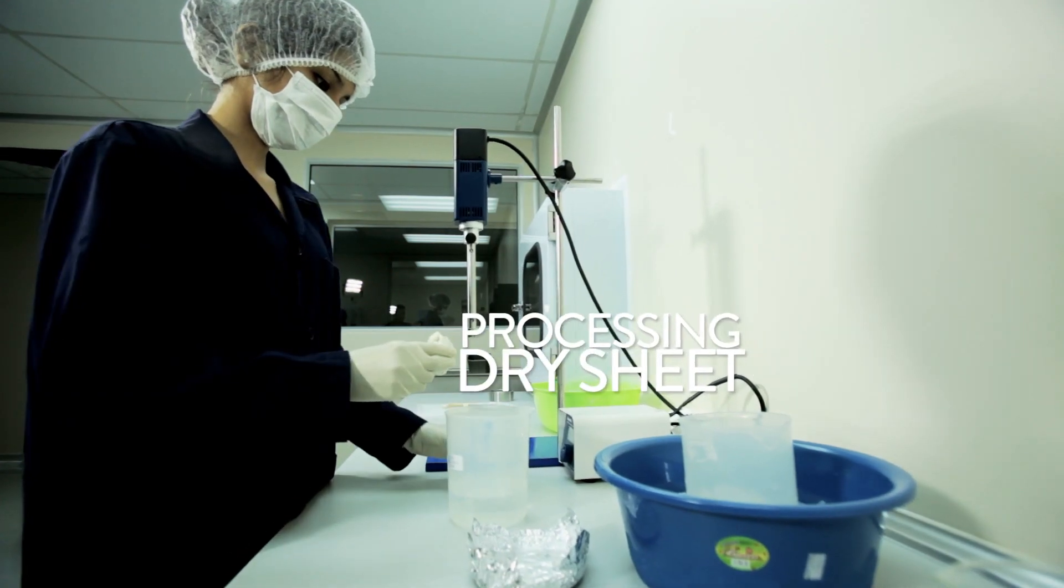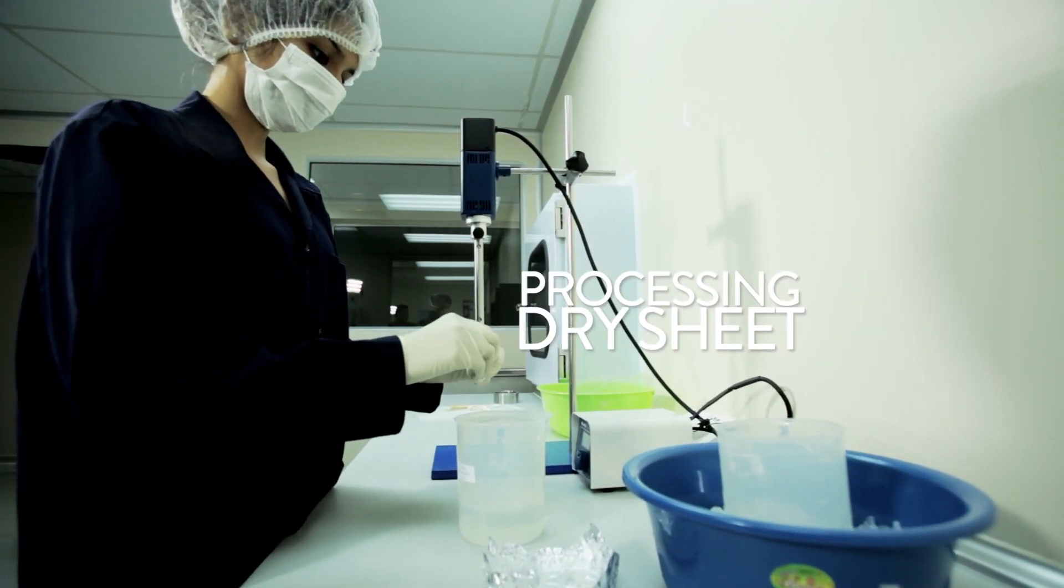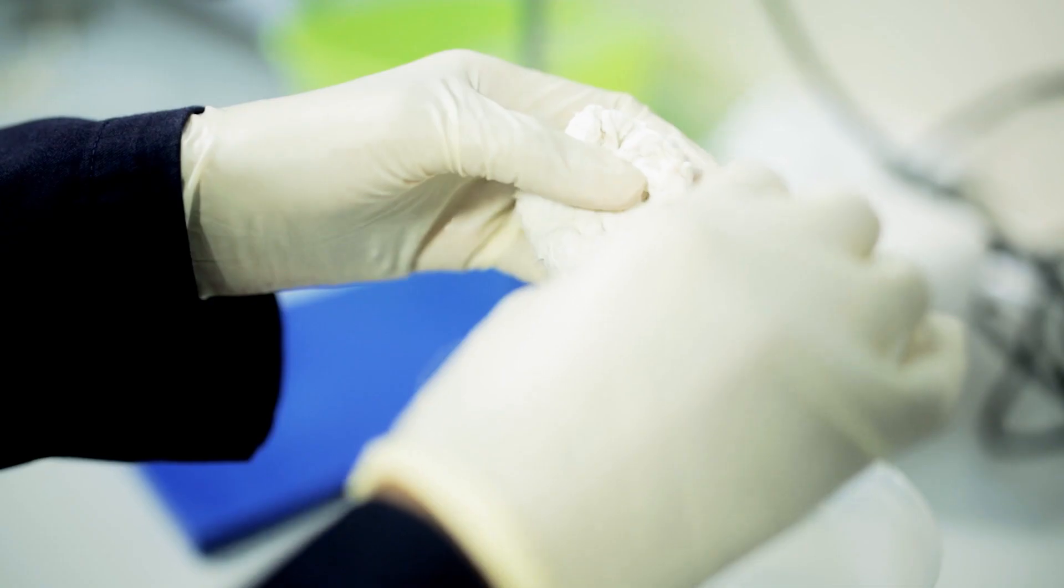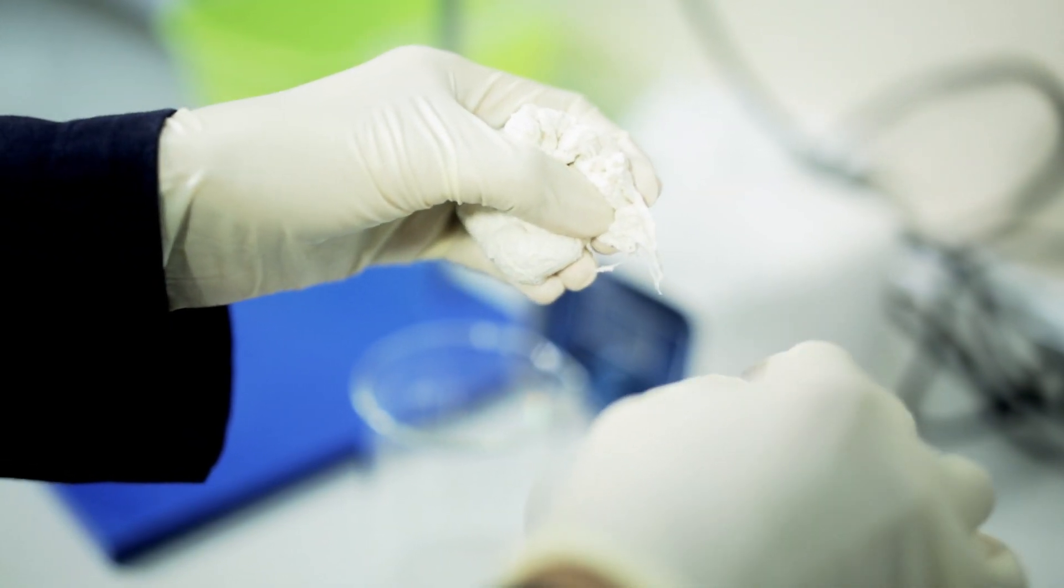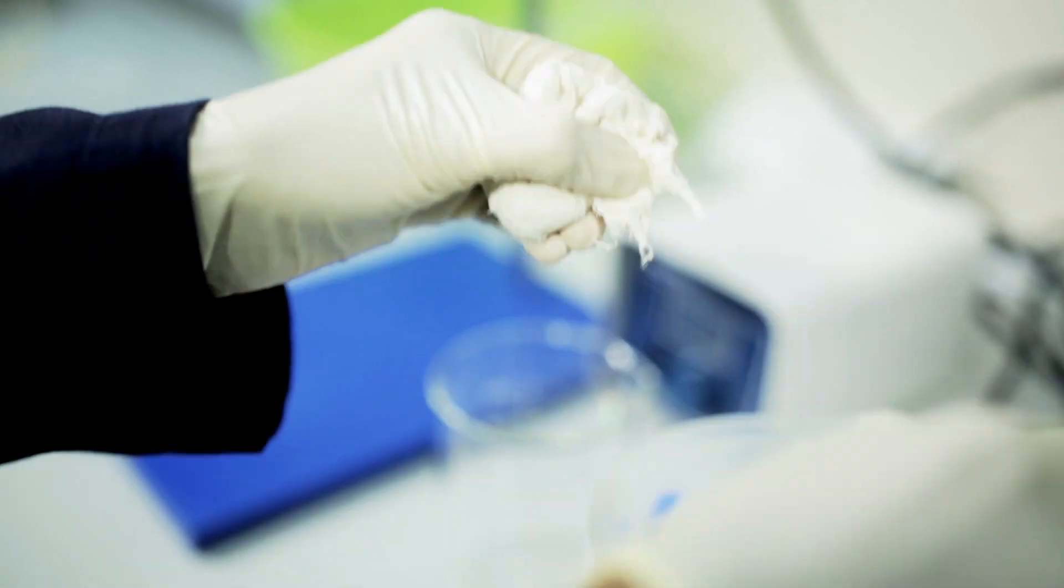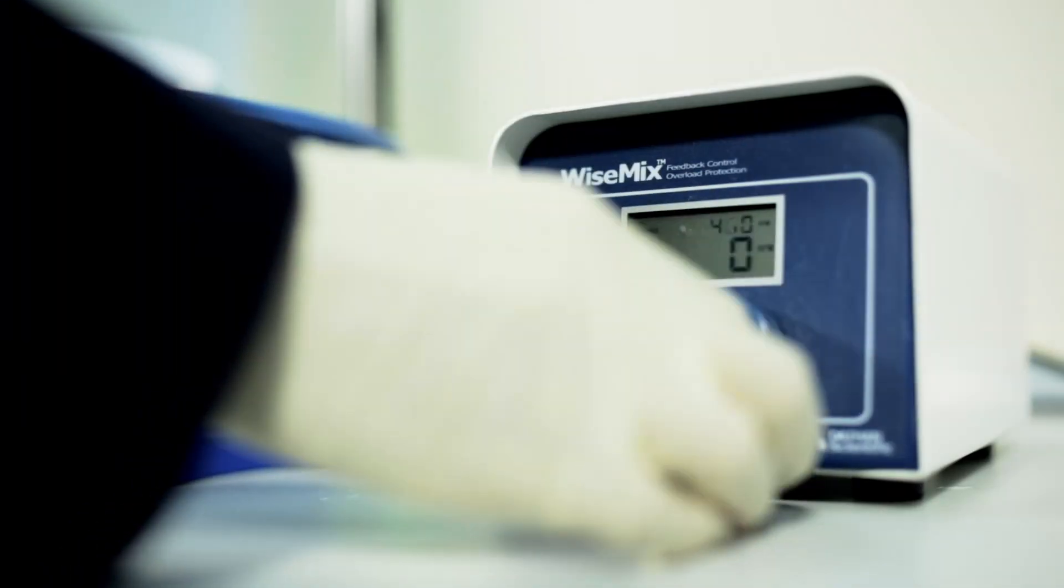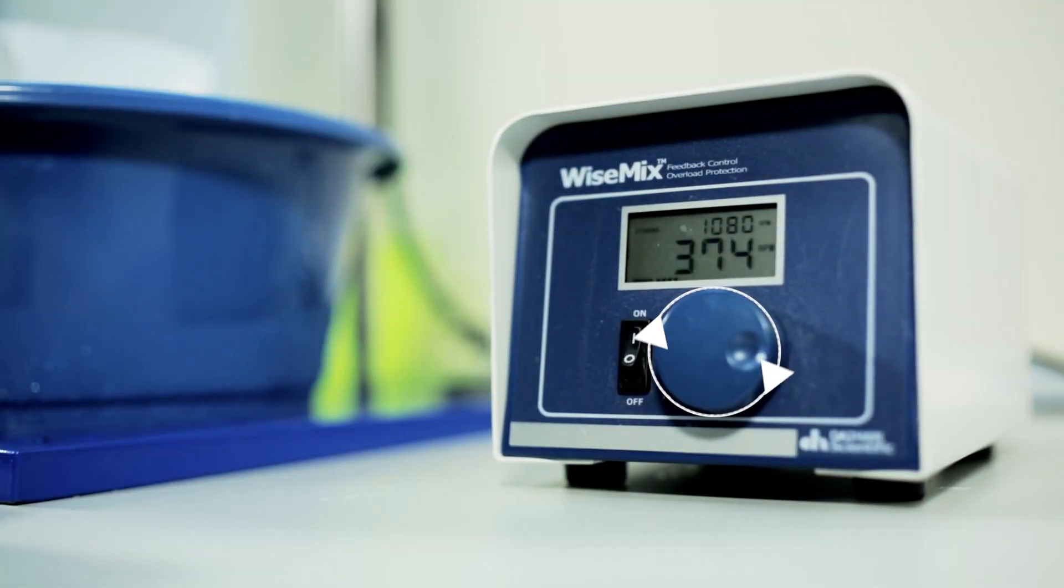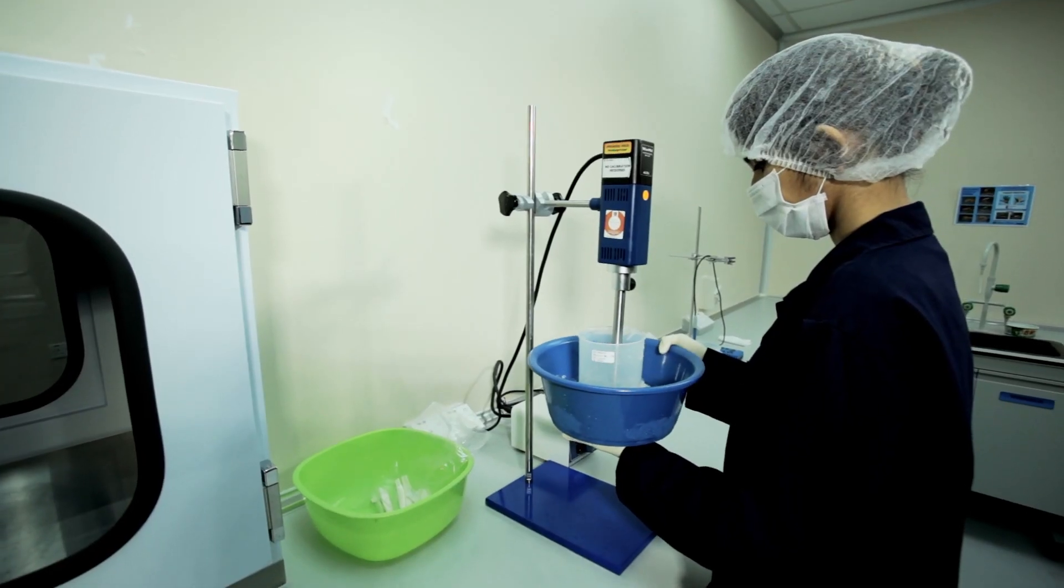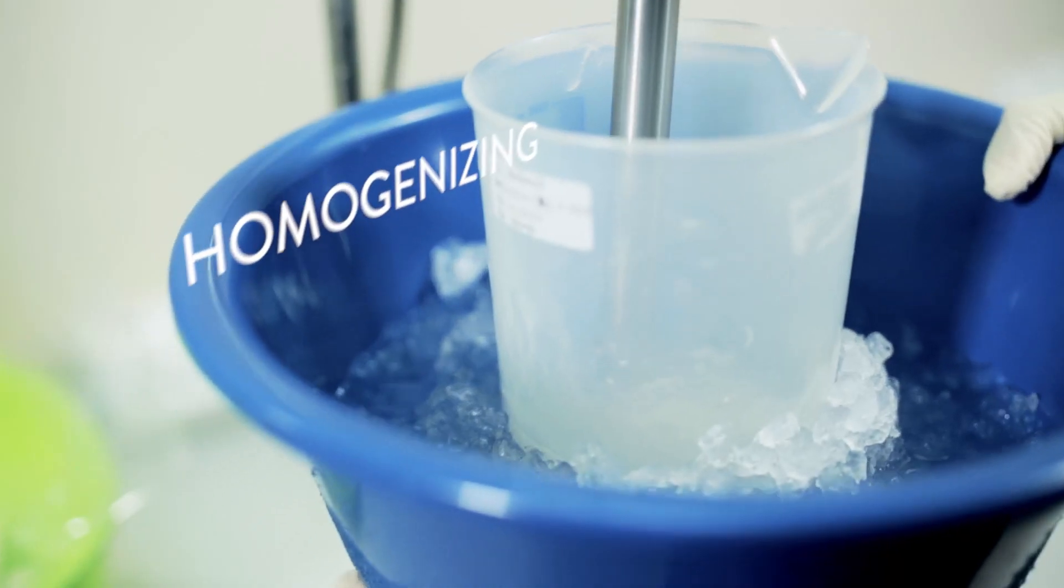For the dry sheet collagen dressing, the bovine tendon is first cut into small pieces and ground into minced tissue. These minced tissues are carefully separated into small strips and treated with enzymes and other chemicals. This process results in a solubilized collagen mixture which can then be used to make the dry sheets of dressing.